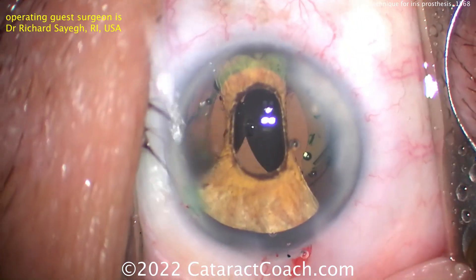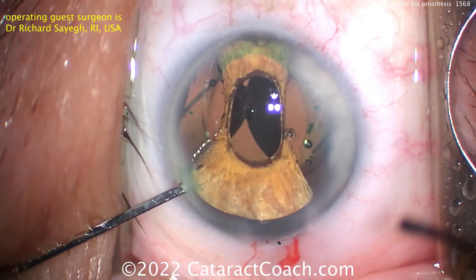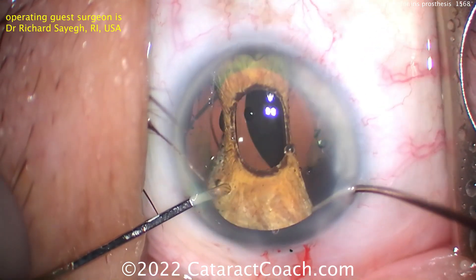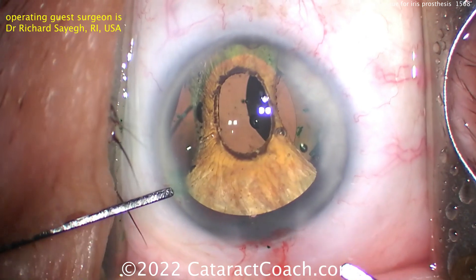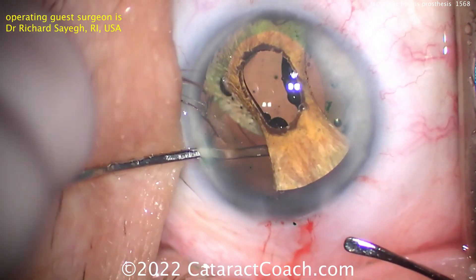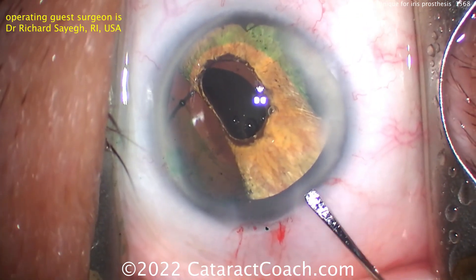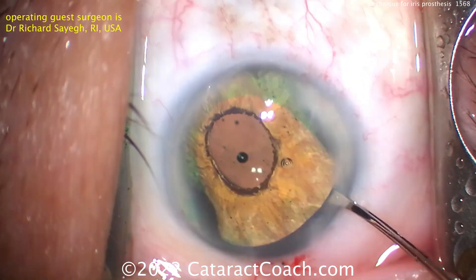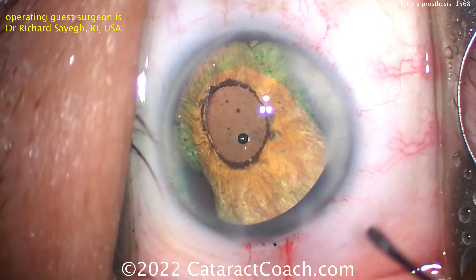Using micro forceps to help get the sub-incisional space done. Going inside the eye — this requires a little bit of manipulation, so two paracentesis incisions. Trying to get this big thing in there, opening up the two side wings. Using plenty of viscoelastic here — if you need extra viscoelastic, feel free to instill more. Now the iris prosthesis is opening up, the two side wings are open, and all that remains is the sub-incisional space.